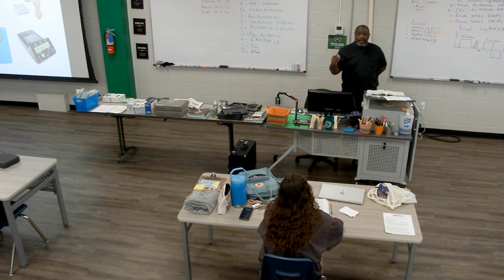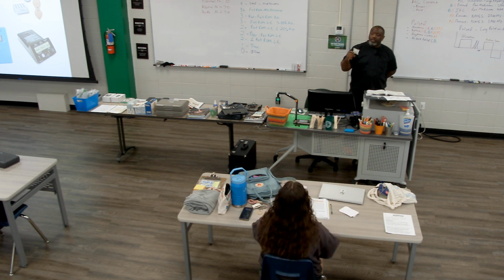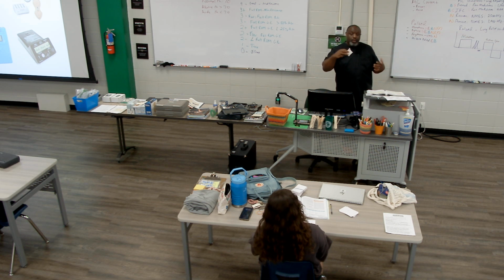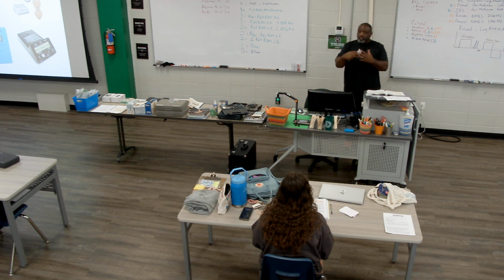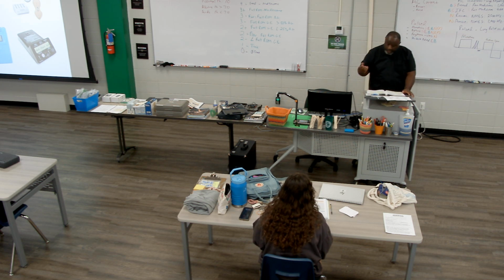If the polarity of your drug is positive, then you're going to use the anode to treat, because you're trying to repel positive from positive. If the drug is negative, you want to use the cathode because you're trying to repel into the system. So the applicator is whatever you choose.